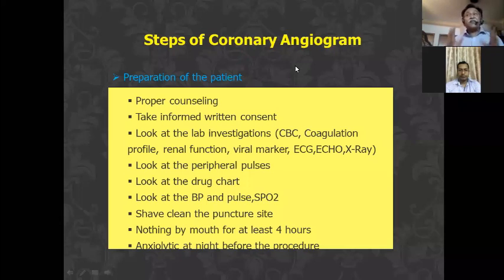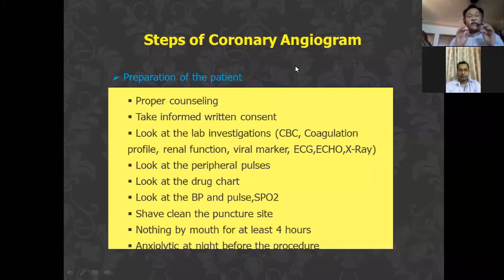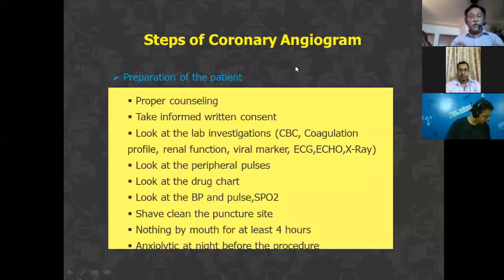At least spend 10-15 minutes with the patient about the procedure, how it is done, how much blood is needed, how painful it is, what the steps of the procedure are. You can show a YouTube animation of the procedure to get the confidence of the patient. So the most important thing is counseling. The next thing is that you should take informed consent of the patient. After counseling, you should explain everything, and the patient will be convinced and will give consent. Yes, I am ready to do this procedure.